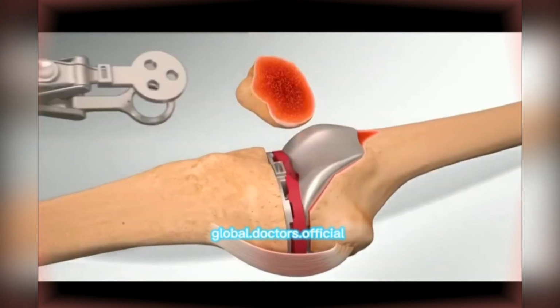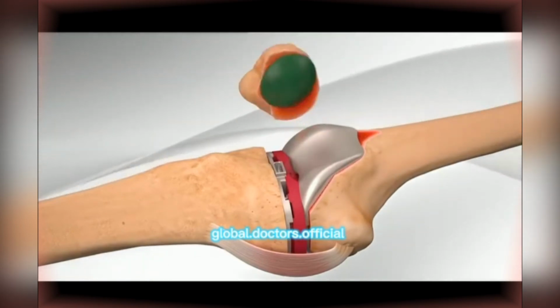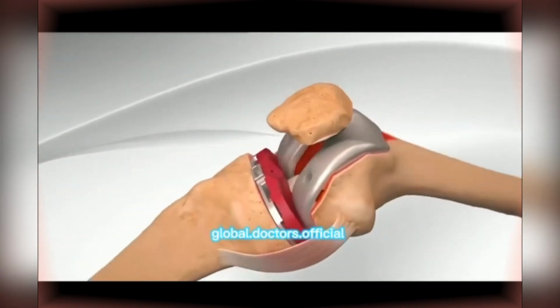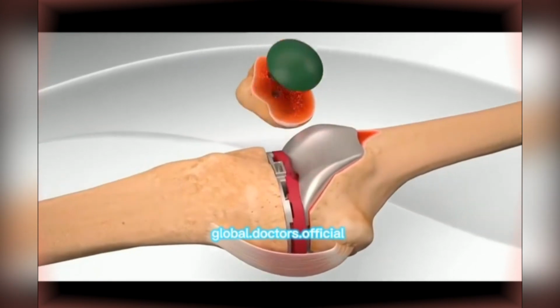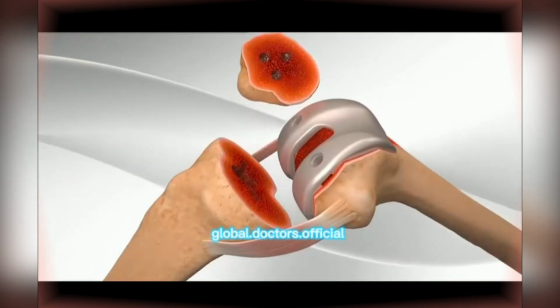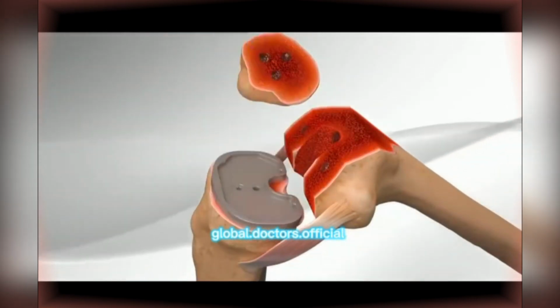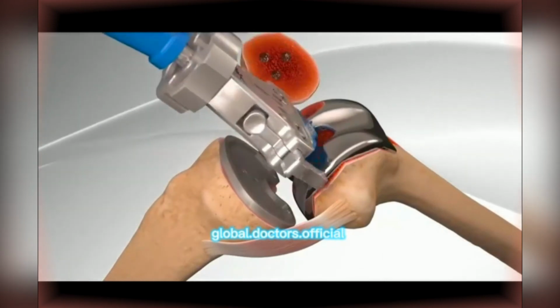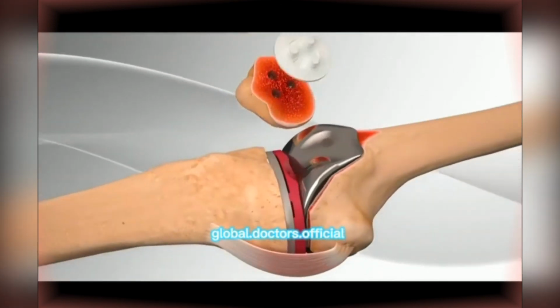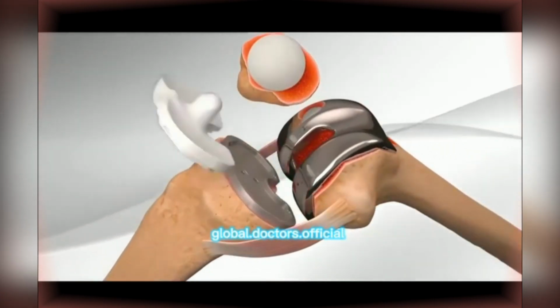Next, your doctor prepares the patella to accept the implant. A trial implant is placed on the patella and the knee is checked for proper implant size and stability. The trial implants are then removed and the surfaces are prepared for placement of the final implants. Your doctor applies bone cement on the backs of the tibia, femur, and patella implants for final fixation. This completes total knee replacement.